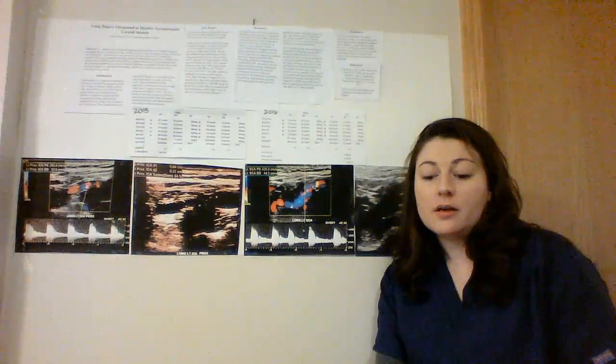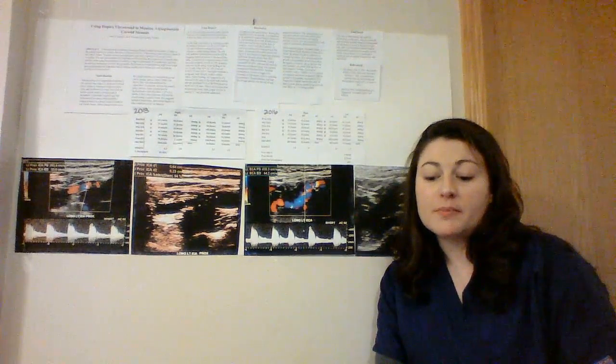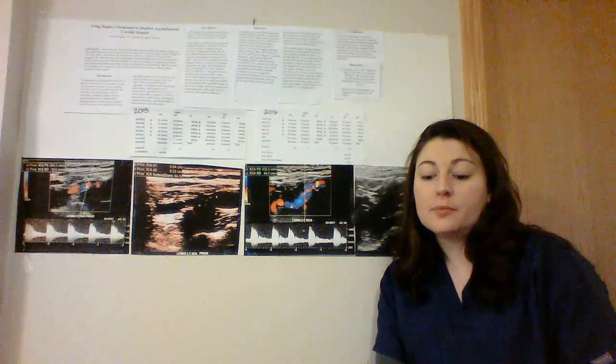It is recommended that at least 2 modalities be used to confirm the degree of stenosis due to the fact that each modality can report either false negative or false positive findings. A few other modalities that are used to visualize carotid arteries are magnetic resonance imaging, known as MRI, and computed tomography angiogram, which is CTA.